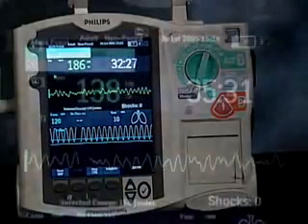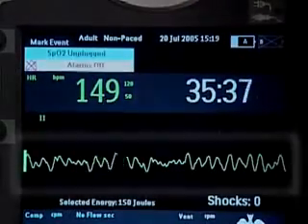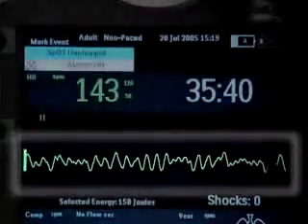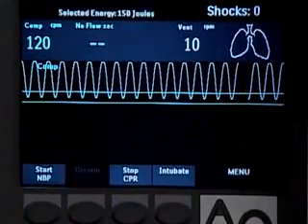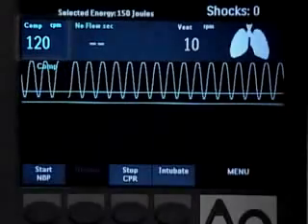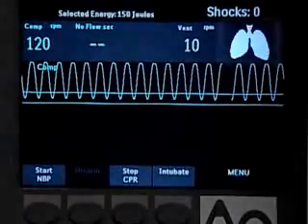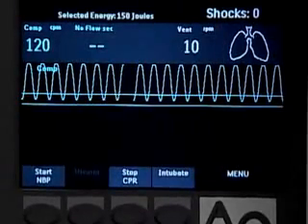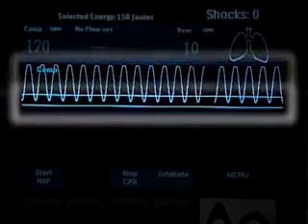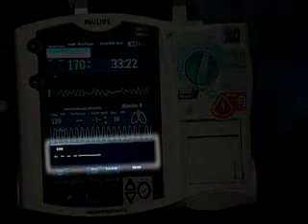Code view of the MRX includes large numeric values for the heart rate and event timer. Wave sectors 1 and 2 are combined for an enlarged view of the ECG waveform. The lower parameter bar includes the QCPR parameters. Compression rate is shown in compressions per minute, no flow time is shown in seconds, ventilation rate is shown in respirations per minute, and the ventilation volume icon is shown on the right side of the parameter bar. Wave sector 3 shows the compression waveform with the indicators for the American Heart Association guidelines for depth. The lowest wave sector 4 can be populated with end-tidal CO2, as I'll now show.